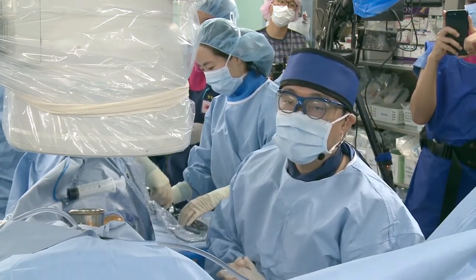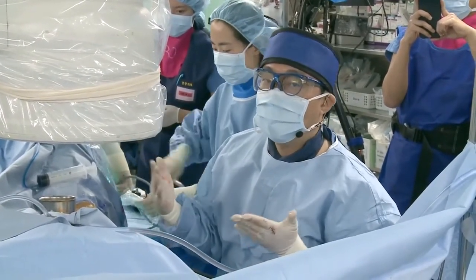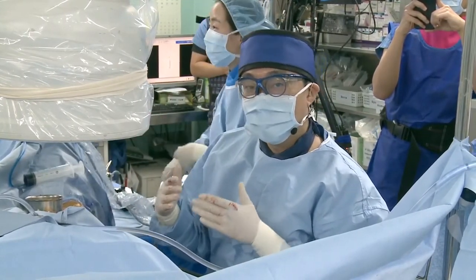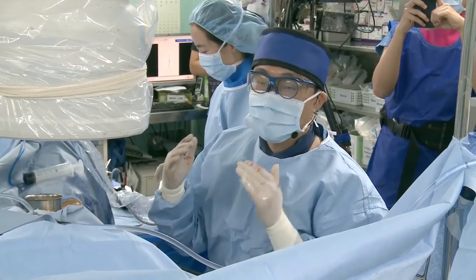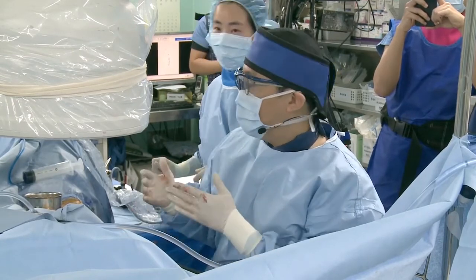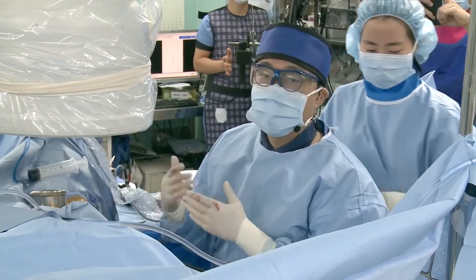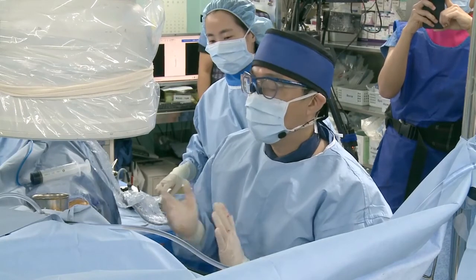My final message is simple: we have to prepare every kind of medical device and surgical technique to prepare a tailored treatment for patients with renal stones, especially when the number of stones is multiple. So I think we have to prepare this setting today. I hope we can talk about this in the future.